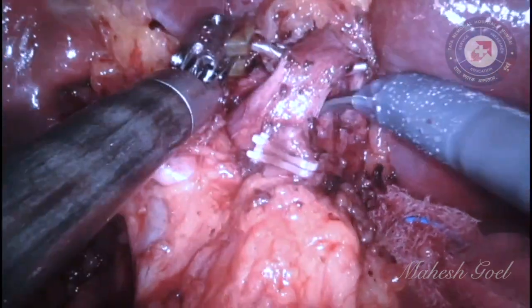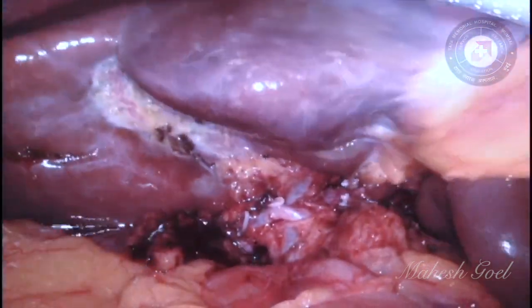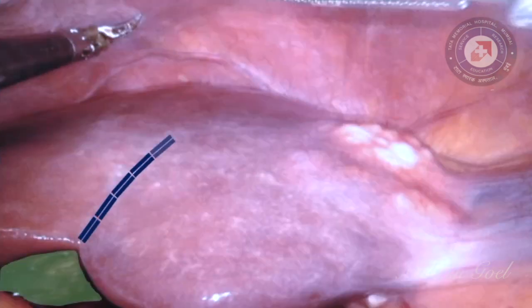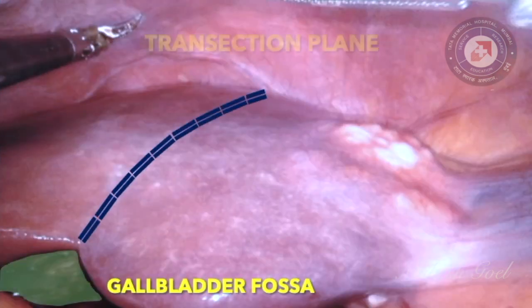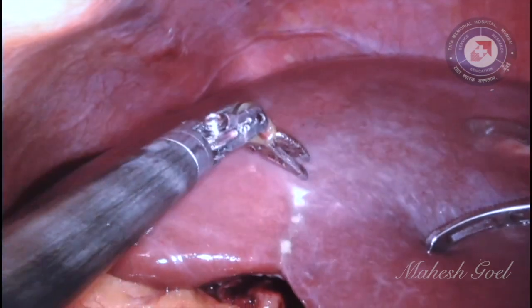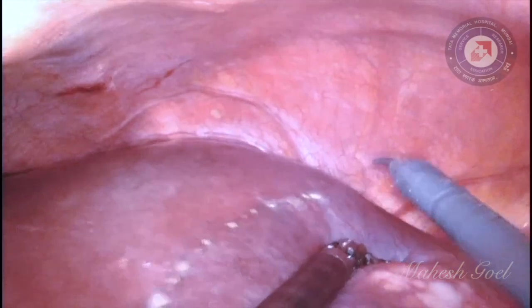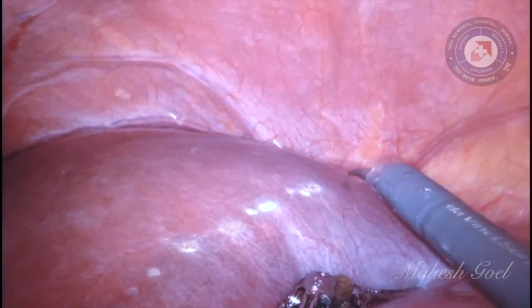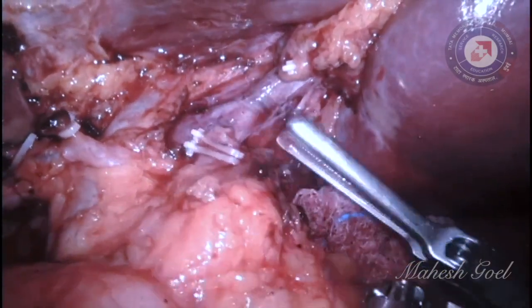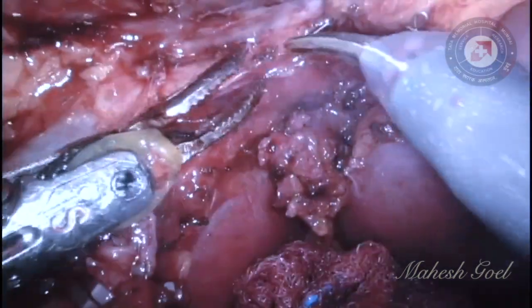The left portal vein, which was meticulously dissected, is clamped. Liver retraction is released and the parenchyma is marked over the capsule for the transection plane, running along Cantlie's line from the gallbladder fossa to the left margin of the IVC at the origin of the left hepatic vein. This is the plane along which a line of demarcation is noted with the division of blood supply to the left liver. The clamp on the left portal vein is then released and the left branch of the portal vein is divided.